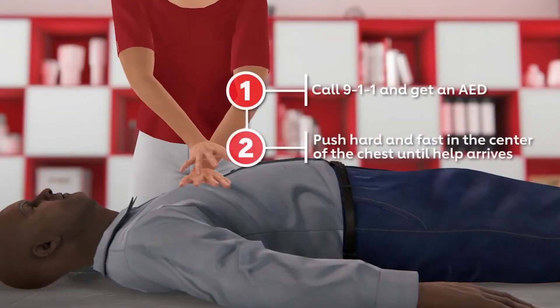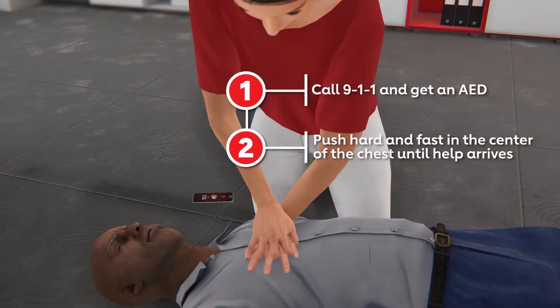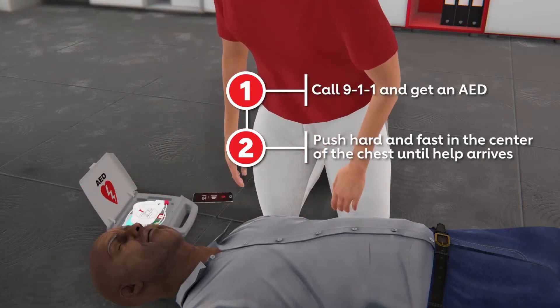You have been performing hands-only CPR on an adult when the AED arrives. You have the victim face up on a firm, flat surface and are ready to continue hands-only CPR with an AED.